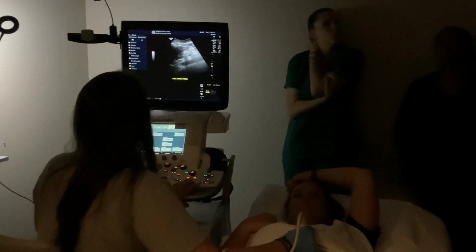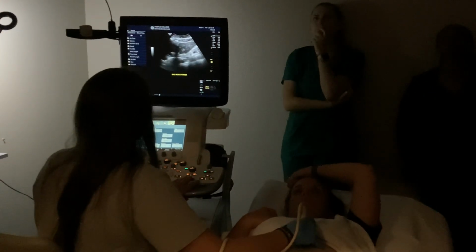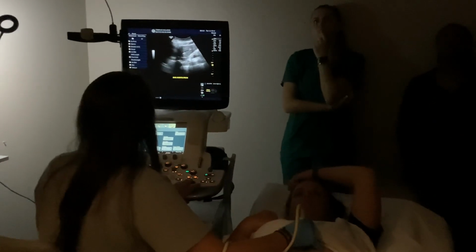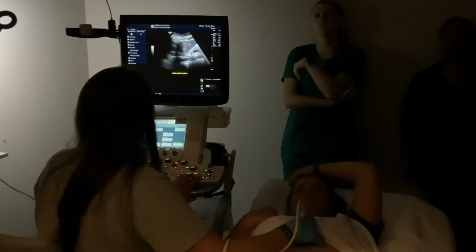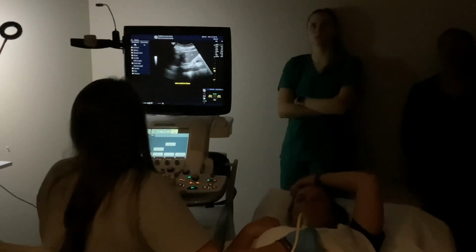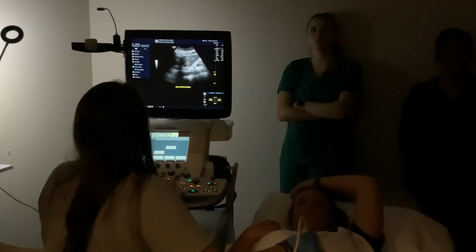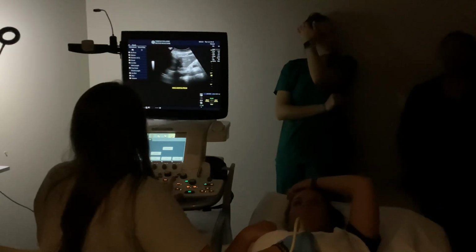Deep breath. Your other landmark is the crus of the diaphragm. You can kind of see. I'm going to take a video on this one to fix it. Okay, breathe. When you figure out how to take a video, this one's a little different. I saw it. There it is.